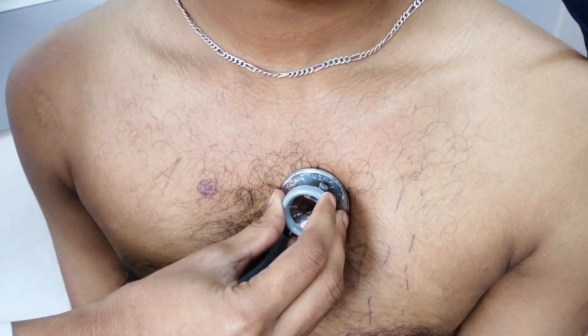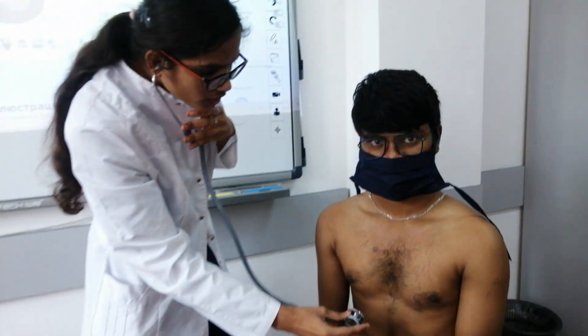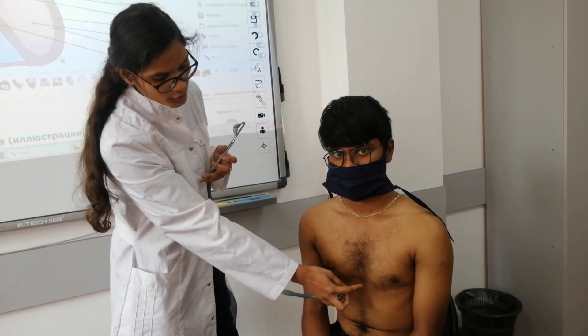Listening for sound. Okay, next point: fourth auscultation point — the tricuspid valve — at the xiphoid process of the sternum.